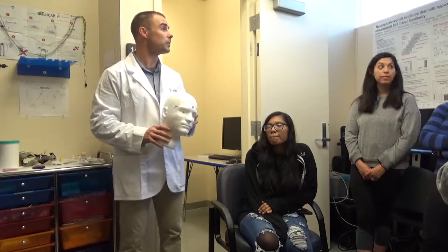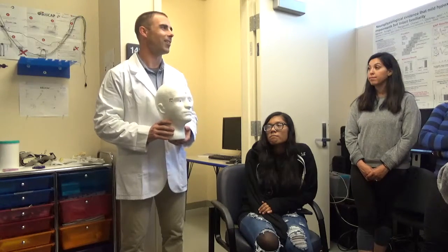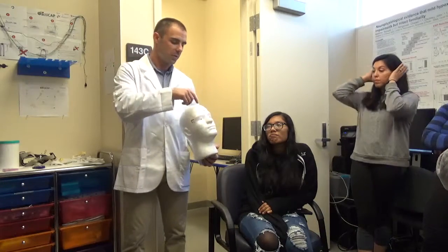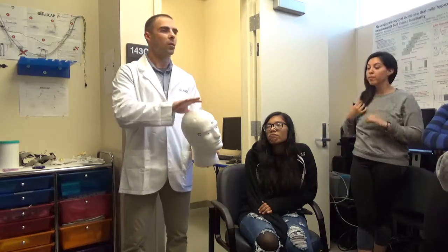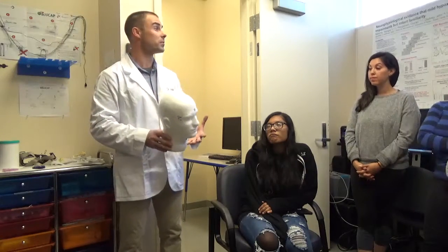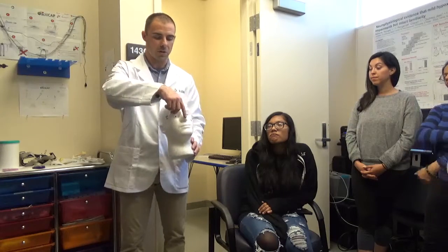Yes? I was just wondering, for the numbering of the scalp, is there a certain way that those... Oh yeah, there is a systematic way that the numbers of our electrodes are organized across the scalp. It's called the International 10-20 system. And the way that it works is we start with the midline.